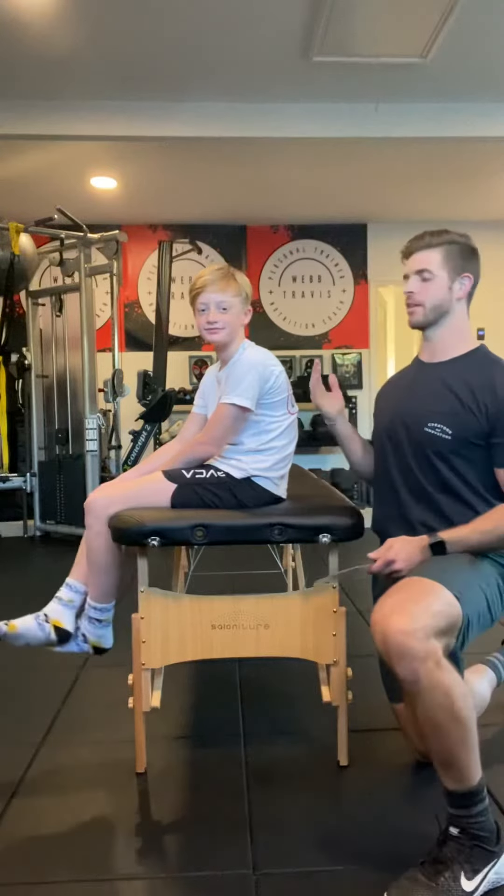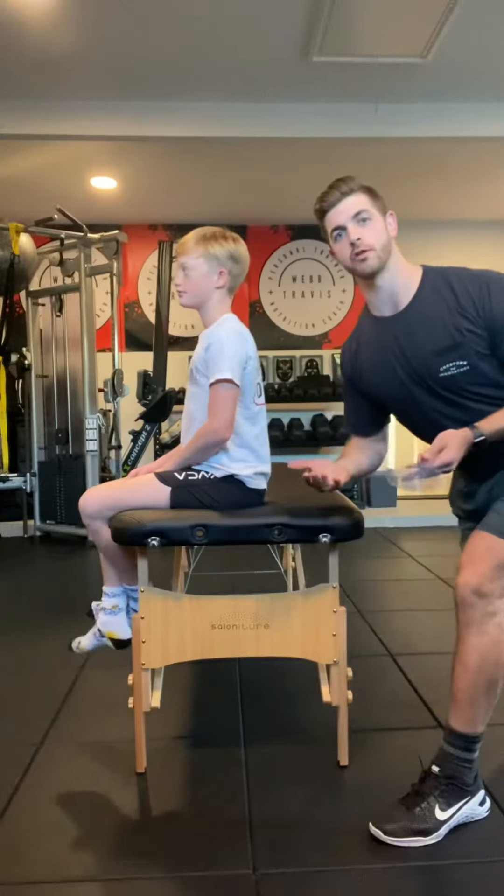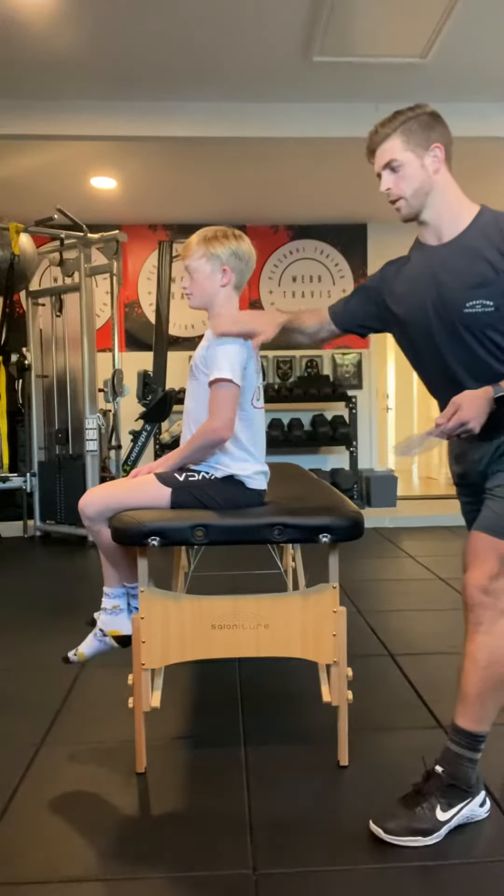We're going to have our client sit up straight, nice and tall, and have him look forward. We're going to see what the shoulder flexion looks like before we do measurements.